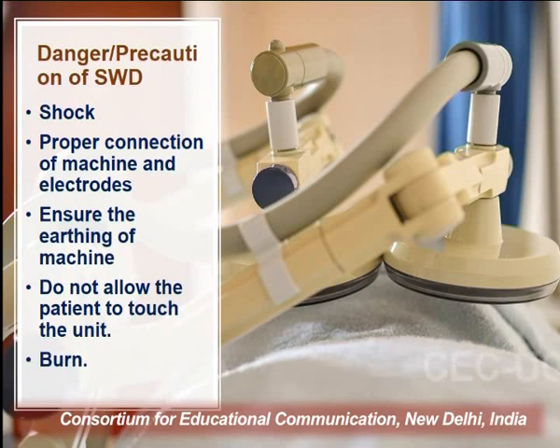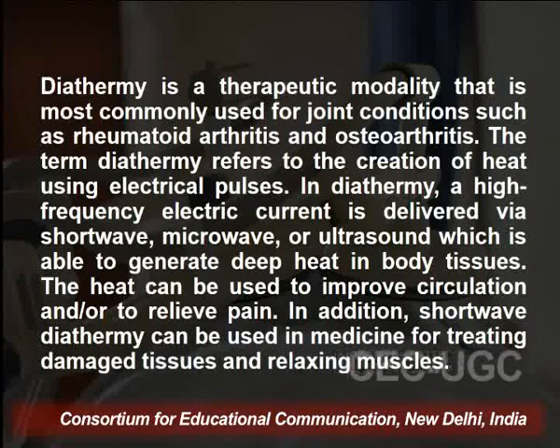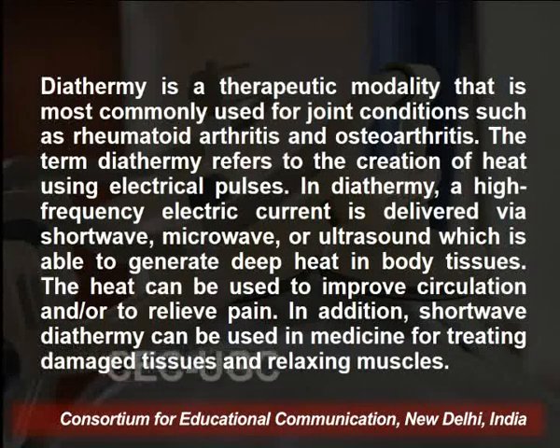Now we have come to the conclusion of short wave diathermy. Diathermy is a treatment modality that is most commonly used for joint conditions such as rheumatoid arthritis or osteoarthritis. The term diathermy refers to the creation of heat using electrical pulses.